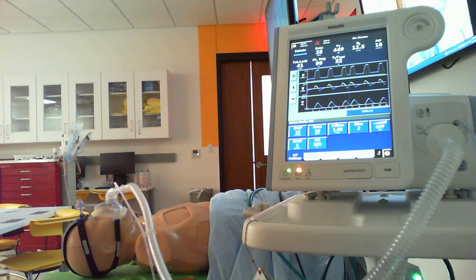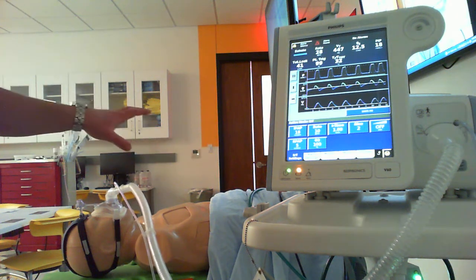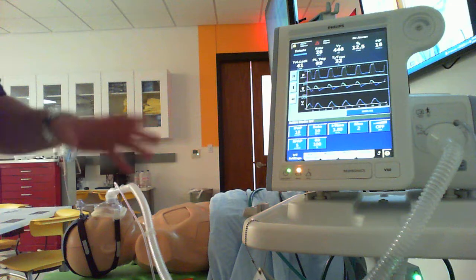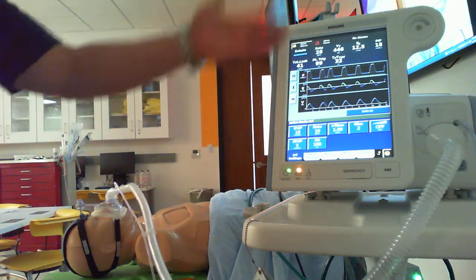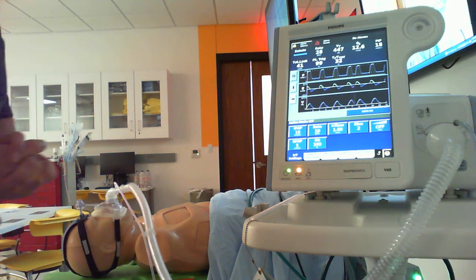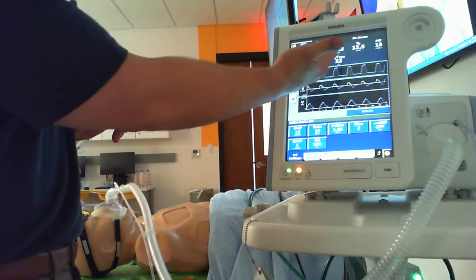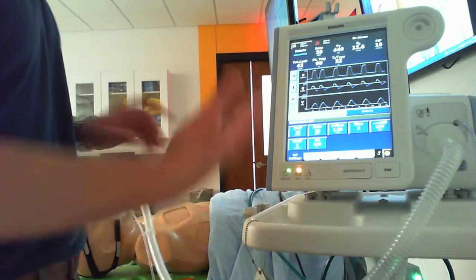You can always confirm with a blood gas if you're worried about it. But usually, if my patient is in impending failure, and I started it based upon that, and the blood gas wasn't deranged or anything, as long as they're showing bedside improvement, I'm okay with that. So I don't always get a blood gas afterwards, kind of a judgment call and a conversation you need to have with the physician. So right now, our rate is good, our tidal volume is good, our minute ventilation is high, okay, but this patient's sick.